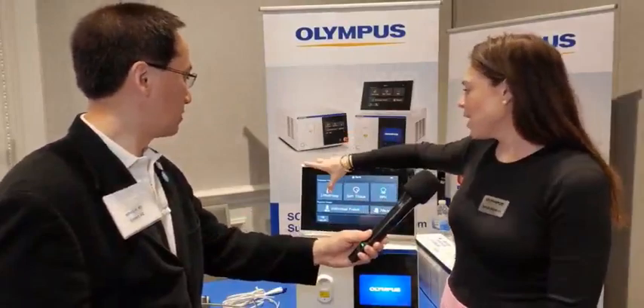Thank you, Dr. Lin. As you know, we have three different settings on our laser — under our lithotripsy, soft tissue, and BPH — and there are already presets set in. So it makes it super user-friendly and easy for your facility to use.